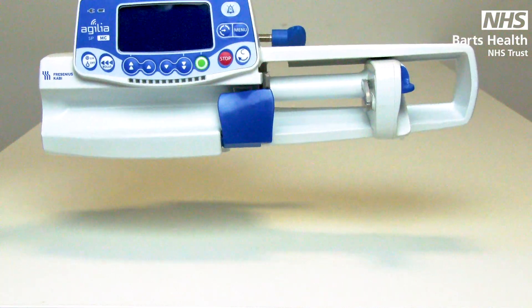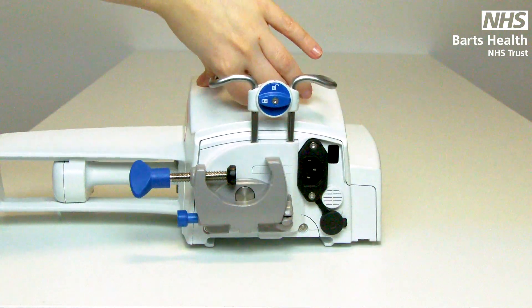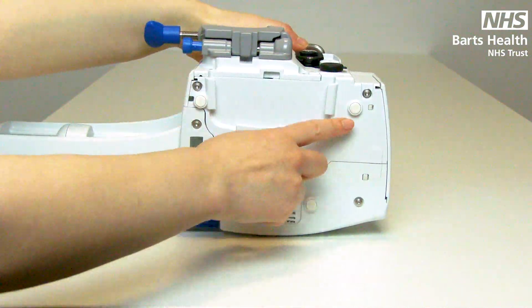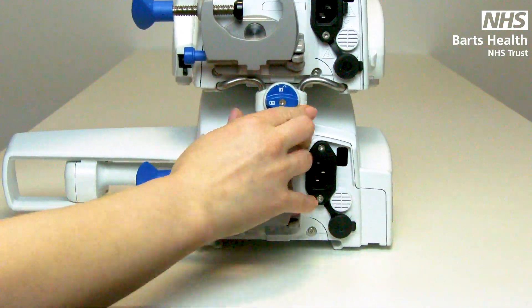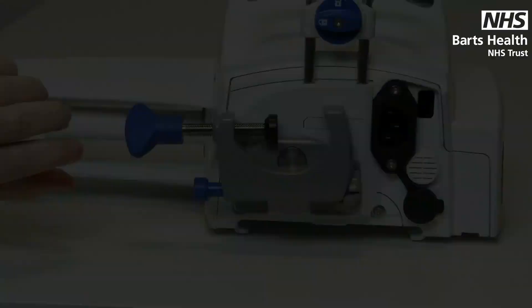Each pump weighs two kilos and the carry handle can be used to stack the pumps together. On the bottom of each device you will find an indentation. This indentation can be used to lock the pumps together — just twist to lock in place. As each device weighs two kilos, we only recommend you stack or carry two at a time. On the back you will find the swing lock clamp.